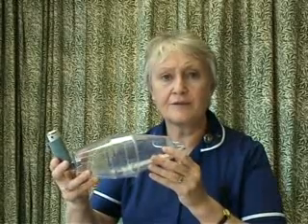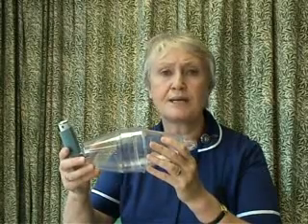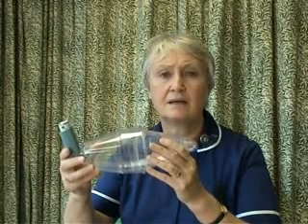Seal your lips round the mouthpiece, depress the canister and take a long slow deep breath in and hold. Repeat that process without pressing the canister. If you need a second dose, repeat the whole process again.